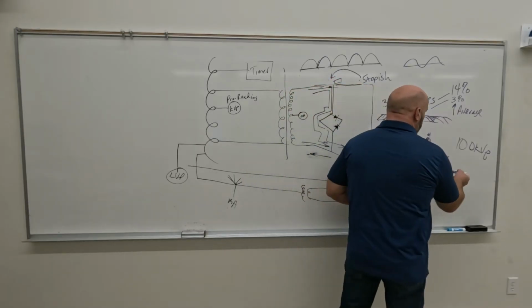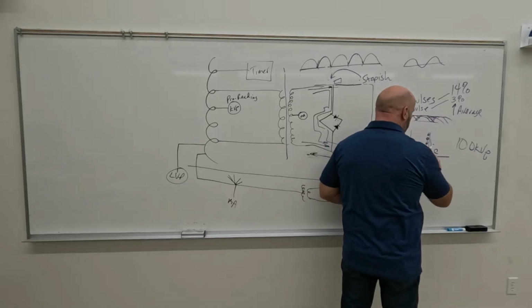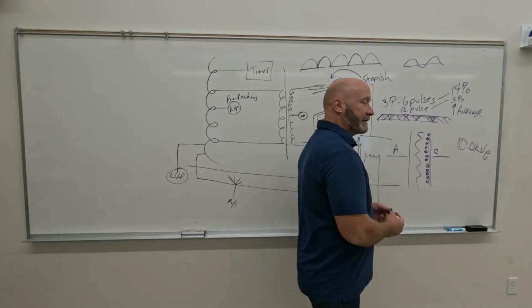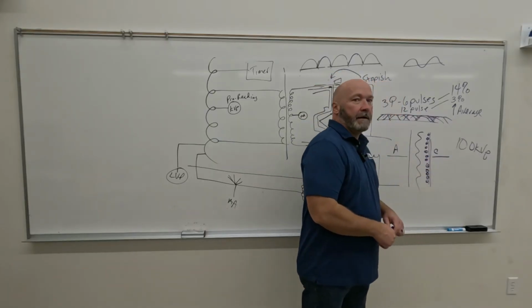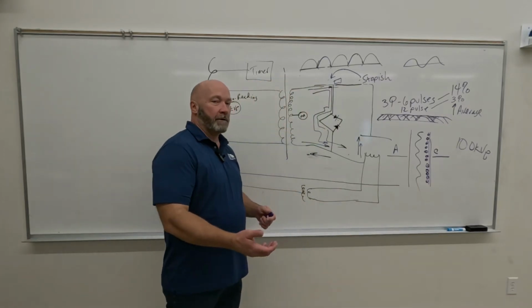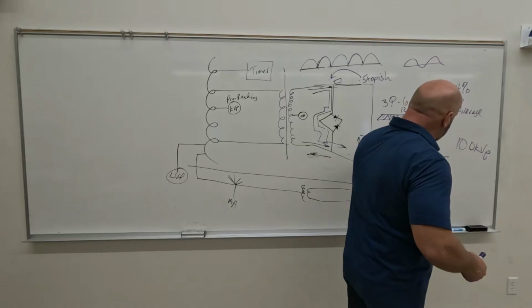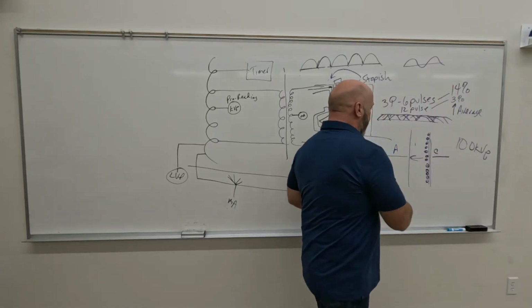So you got your capacitor charged up because you plugged your portable in, and you got all these electrons, but you've got something, be it a distance or something, that prevents those electrons from jumping this gap. Once you get the charge that you need, then you can break down that insulation in between them, so that electrons can jump across and make your exposure.